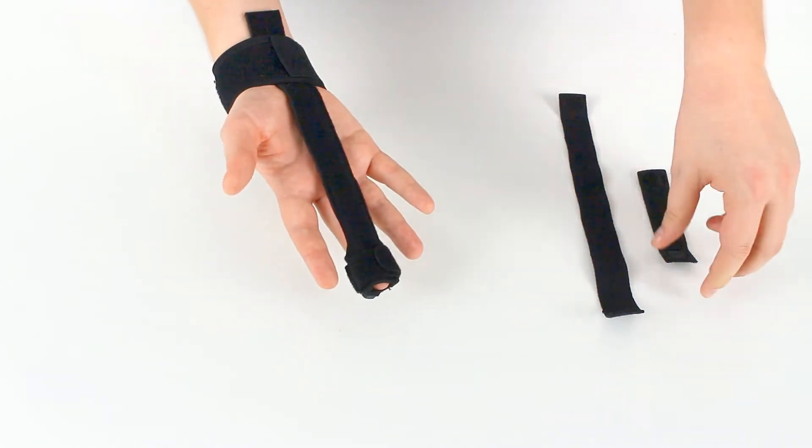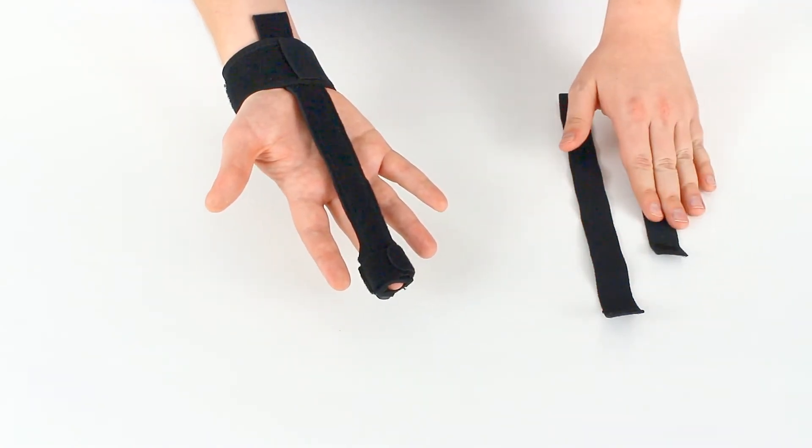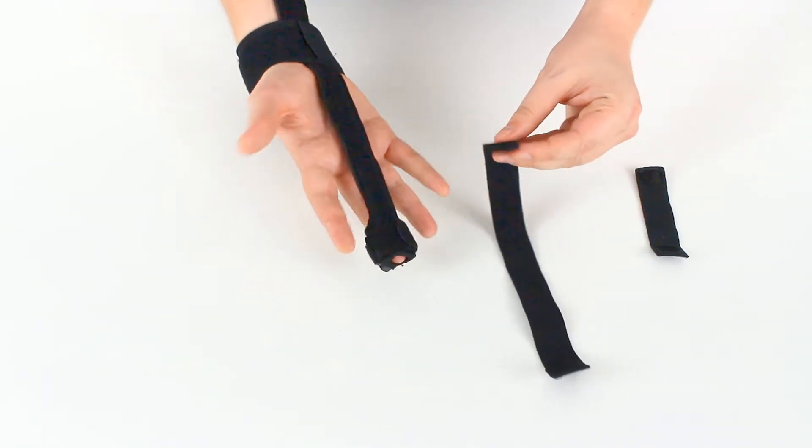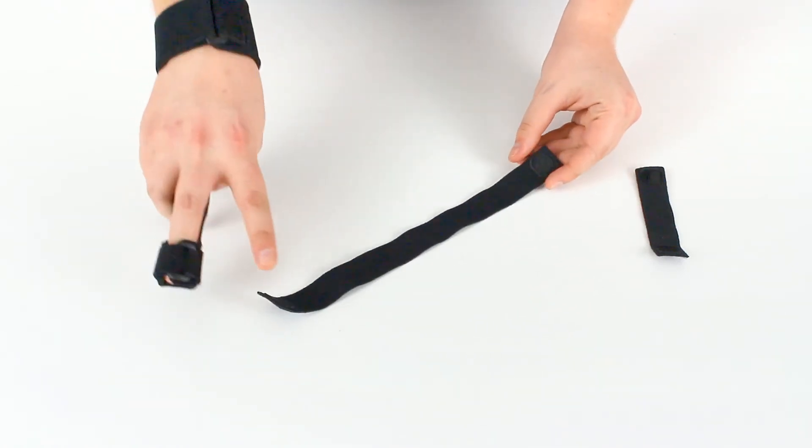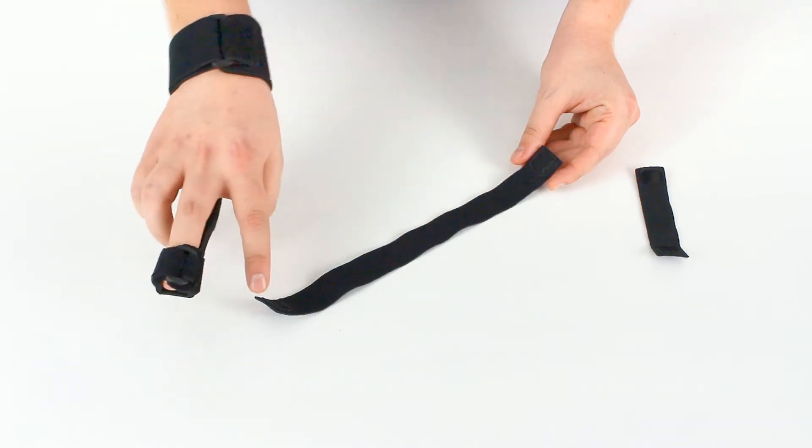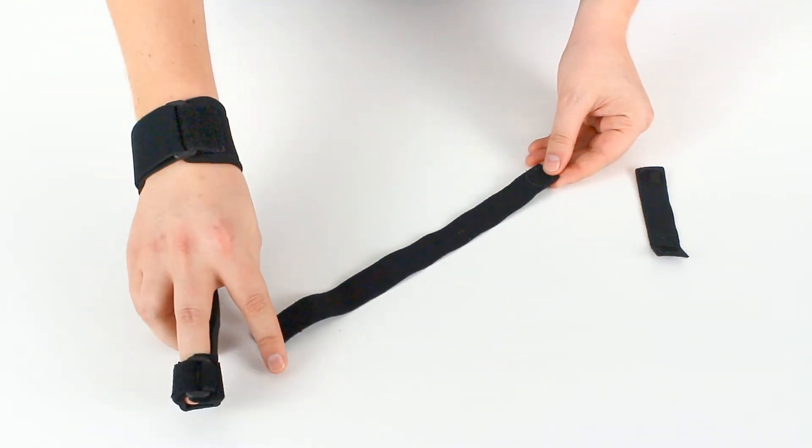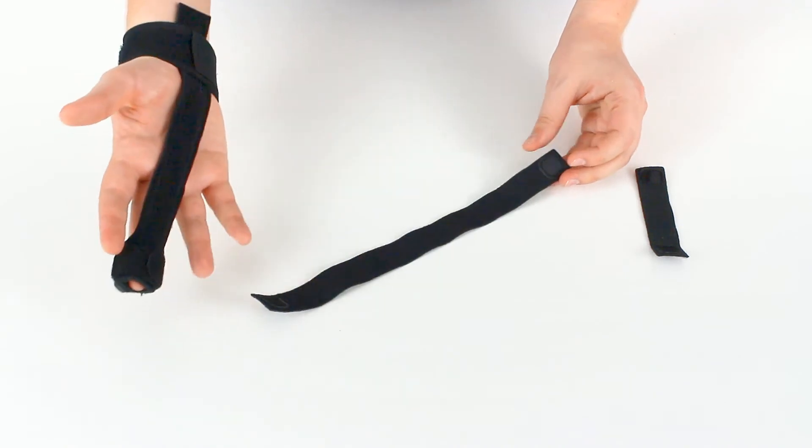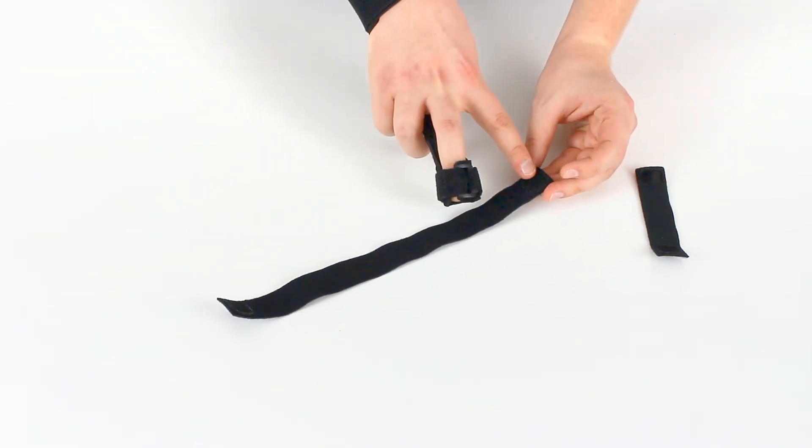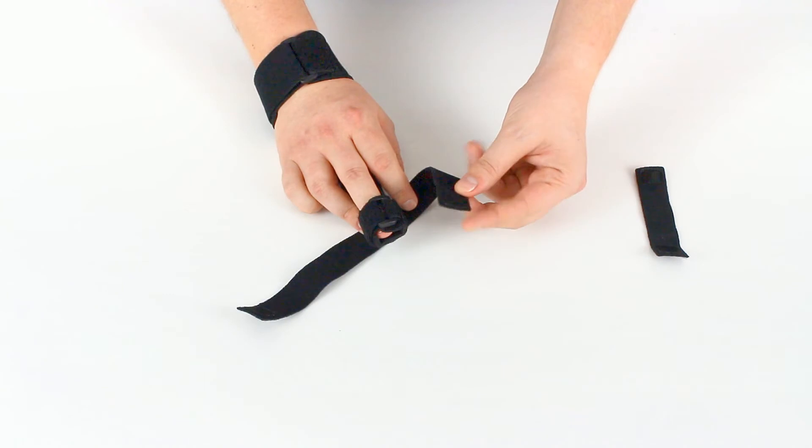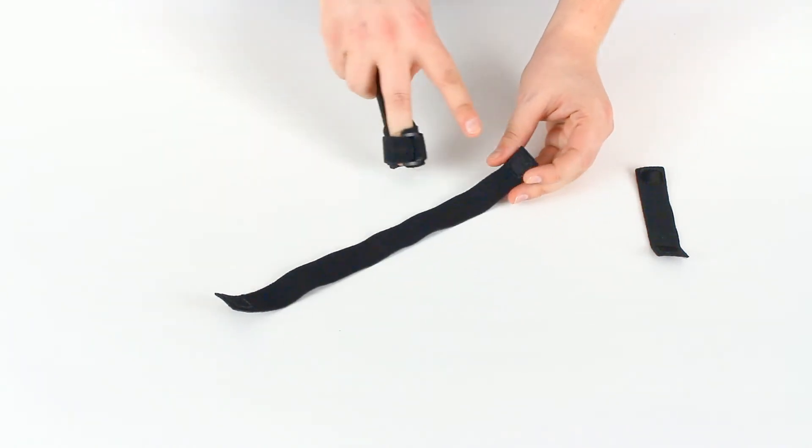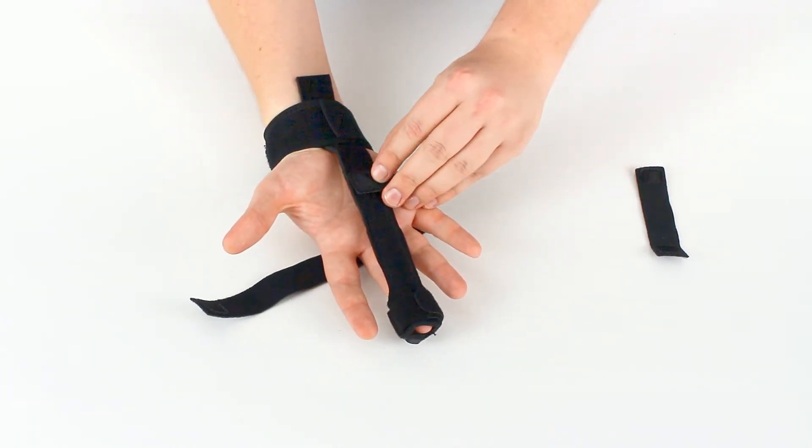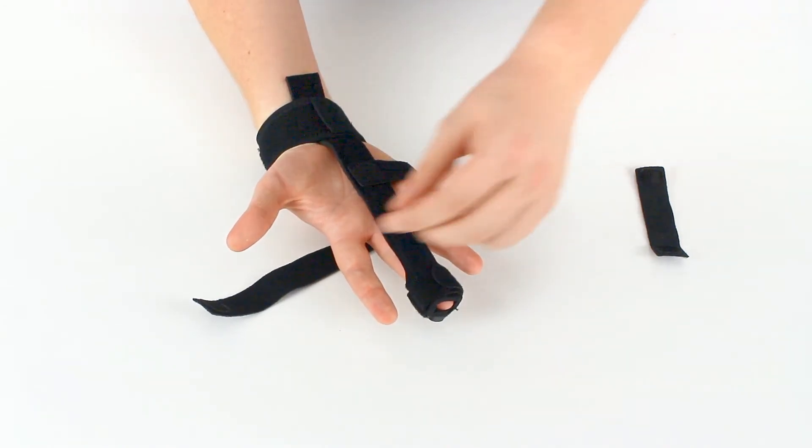What we'll do now is select either one of these. We'll start with the palm strap here. The palm strap has two patches of velcro on one side and one patch on the other. We want to fit that double-sided end. So there's two on one end and two on one side. We want to fit that onto our palm there.